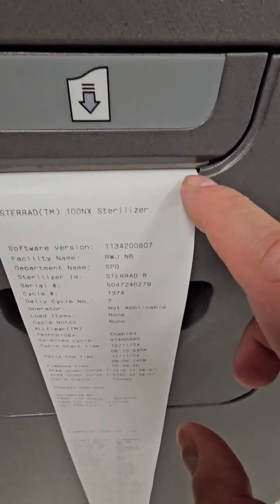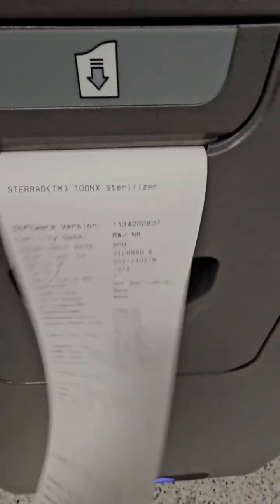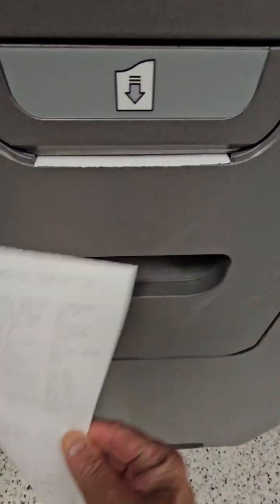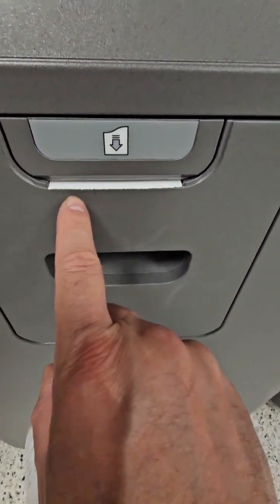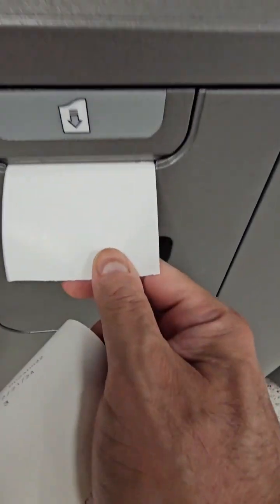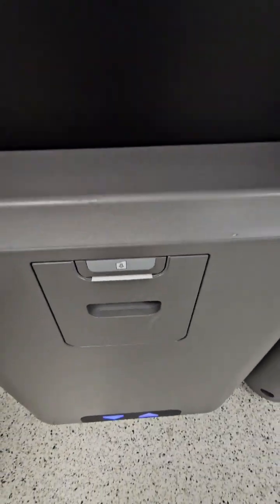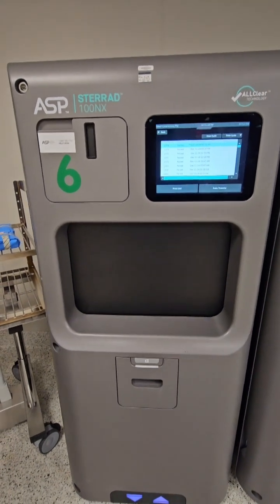One thing I do not like about these sterilizers: the printers are horrible — they jam up all the time. If you get that accordion-style paper coming out or you're printing and don't see the printout, open that little door and I guarantee you're going to see the paper jammed in there. The way people tear off the paper or load it causes the issue. There are two little notches on the side and that paper has to sit perfectly in that notch. The blade is on top so you'd think tearing upward makes sense, but trust me — down and away gets the best results. And that's my tutorial of the Sterrad 100 NX with all-clear technology.